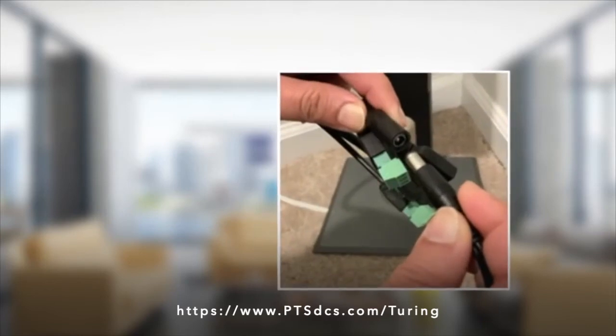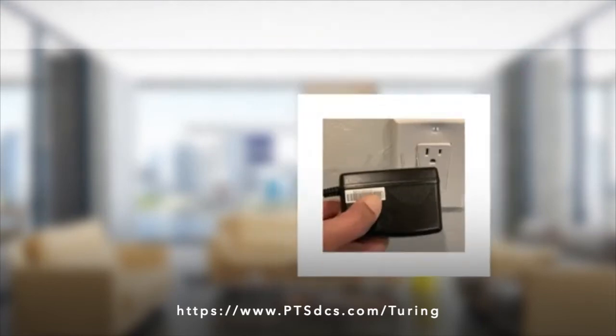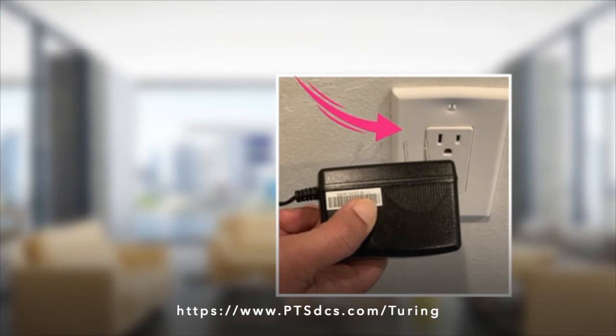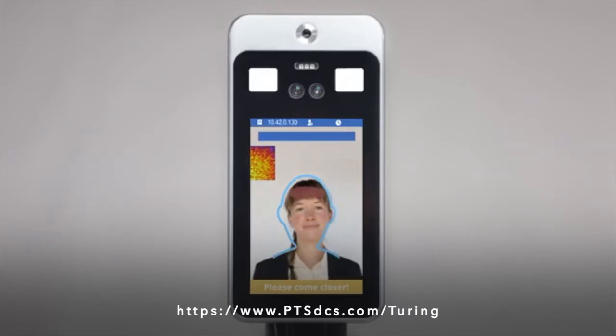Attach the power adapter to the 12-volt power cable of the scanner. Plug in the power adapter to a plug outlet and power on. The camera automatically starts and the scanner may take up to 5 minutes to boot. The outline of a head and shoulders appears on the screen and voila, your scanner is ready to use.